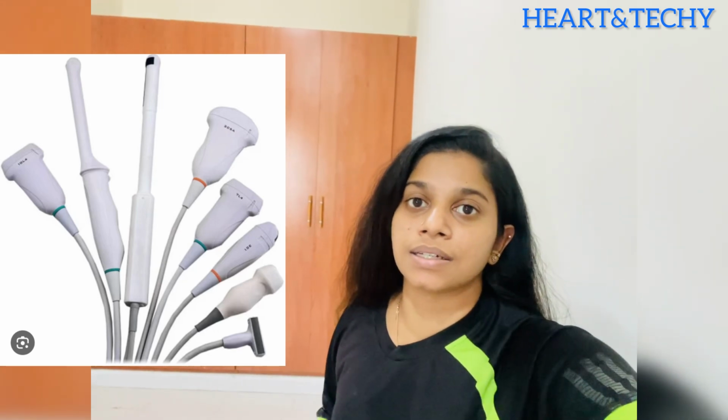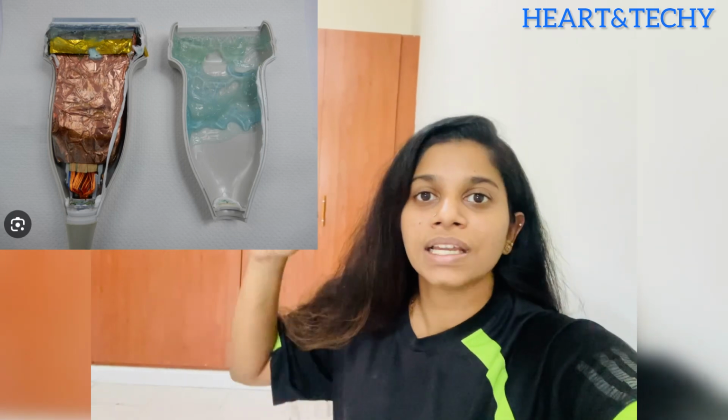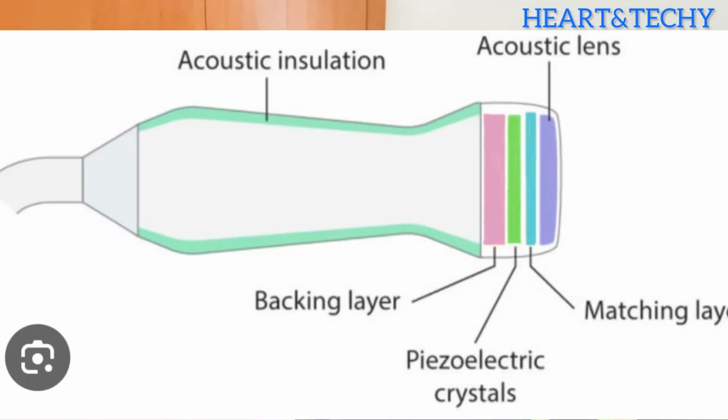These are the different shapes of probes, but when we take a cross section of a probe by opening it, the basics are the same for all. Only the size and the arrangement of the piezoelectric crystals are different in different probes. That's it. As you can see, these are the parts of the ultrasound probe.